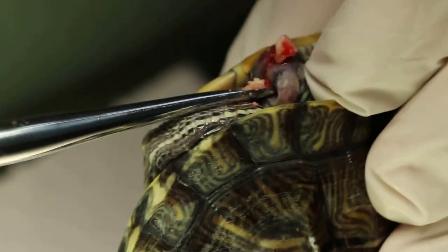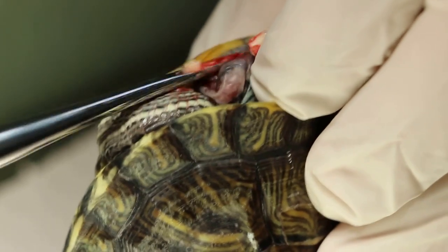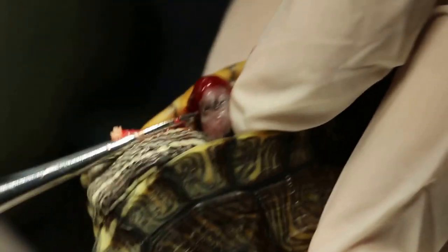Put it on. You can see the pus — the thick pus. There's a lot of material coming up here, more and more. It's been accumulating for several months. We remove as much as we can while under anesthetic with isoflurane gas in a container. It's quite deep in here.